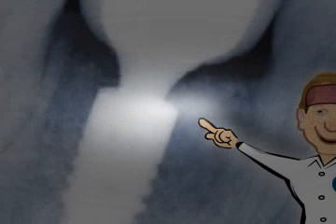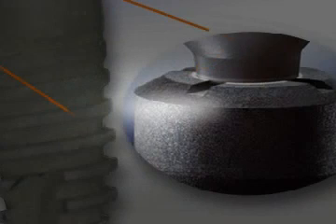However, bone reduction does not appear to occur with conical connections, and the reasons for this could not initially be explained. As a result, producers renounced polished surfaces. Implants with conical connections showed bone development all the way to the abutment. Thus, even the implant shoulders are now roughed up.